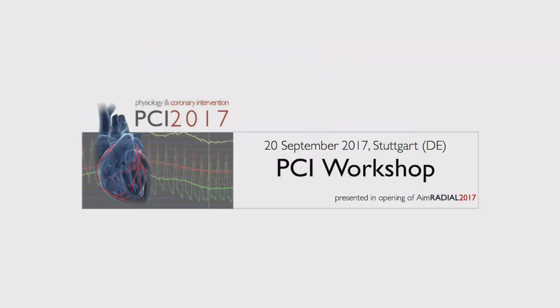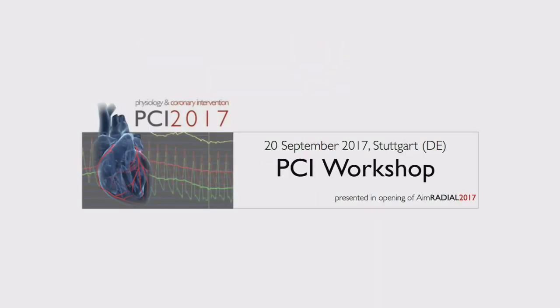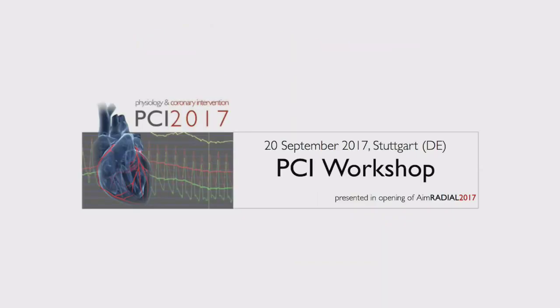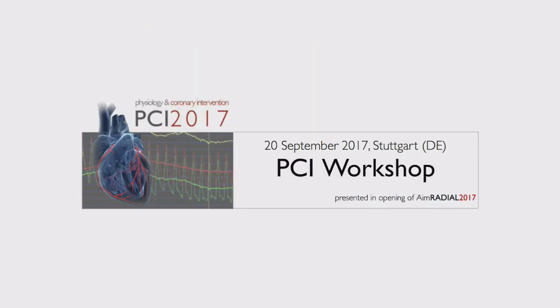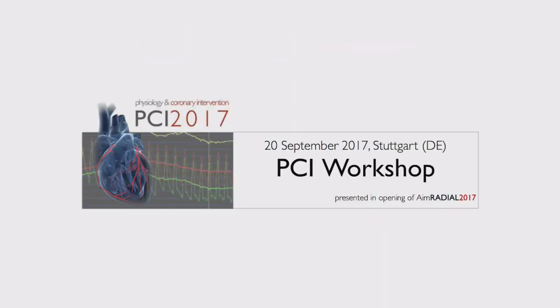Of course, population-wise, we know that the higher is better, but even by higher, I mean, of course, less diffuse disease. So this is why I think that post-PCI FFR cannot be as helpful as pre-PCI FFR in deciding what you have to do in the cath lab with your own hands. This is what it says to me, that it's a little more complex picture, and this is more difficult. There are many more things to be taken into account. And the LAD is different. Of course, we know that having a post-PCI FFR above 0.90 happens in less than 40% of the cases. Yeah.